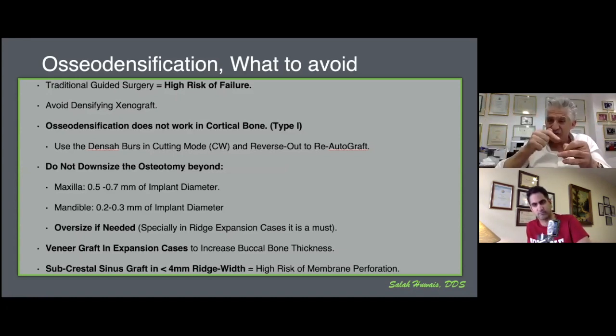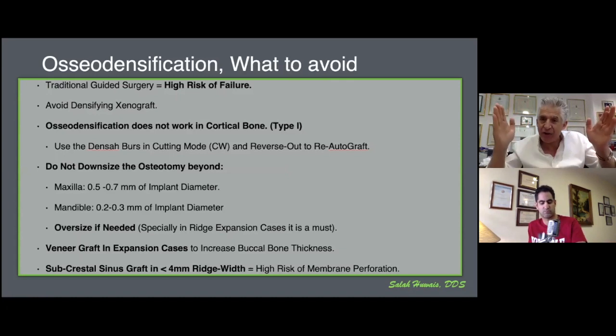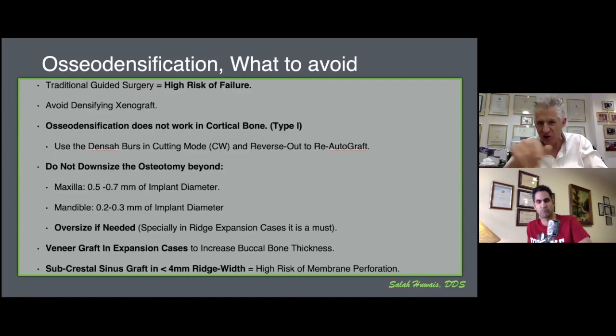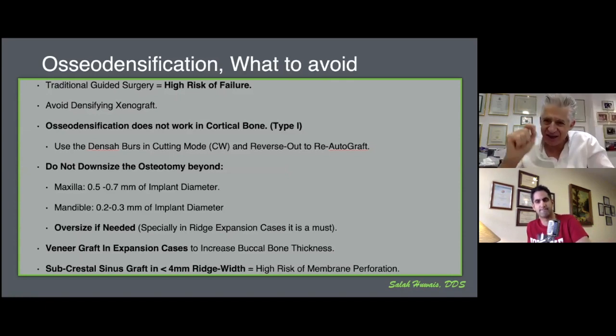So the irrigation with traditional guides doesn't reach the drill and doesn't get propelled along the flutes of the drill to mix with the milled bone particles to create this hydrodynamic compression wave and push the bone laterally and apically. So you've got to use a special guide, and I'll show you one. It's a new development. It's called the C guide, like the letter C. Why C? Because C means it's open on the one side so that the irrigation can reach the drill.